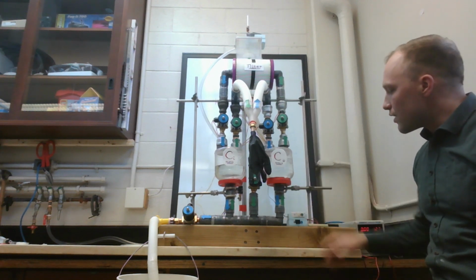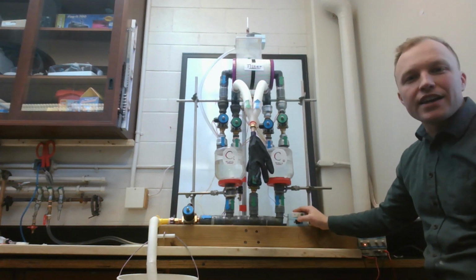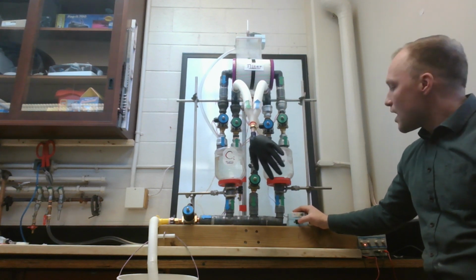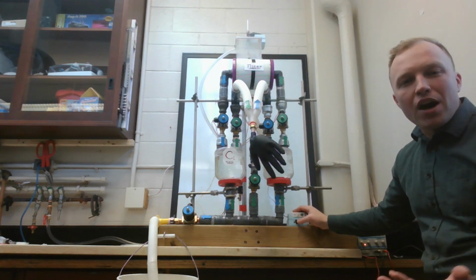So we turn it on, and the glove inhales, and we turn this drain on, and the glove exhales. And we're able to turn it on and off to create inhaling and exhaling of the glove and control the breath of the body.